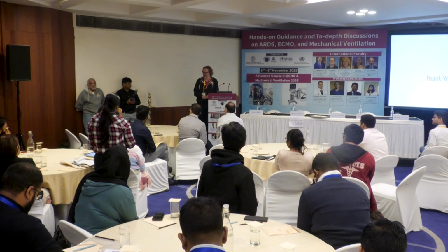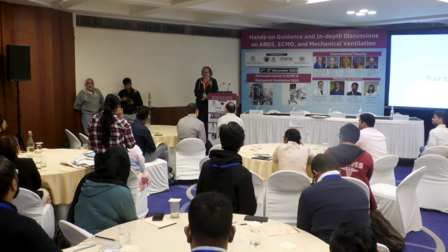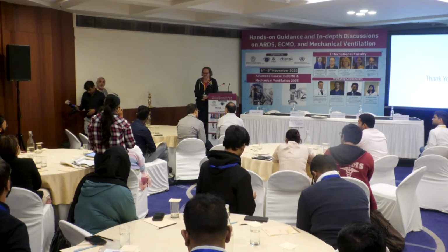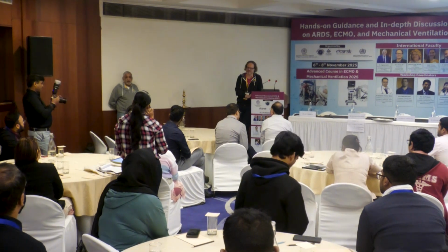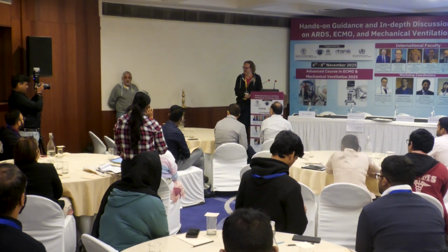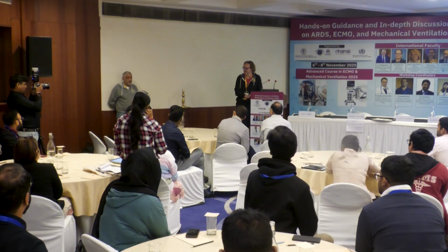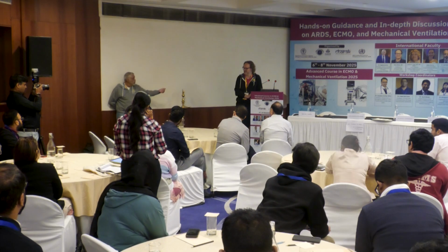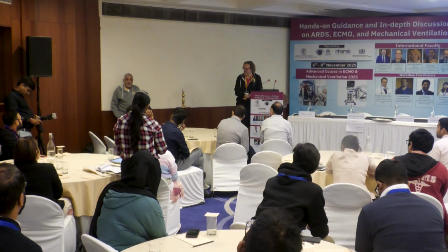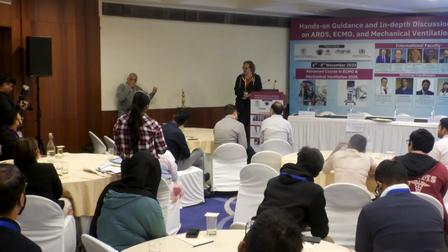Dietrich is, okay, so one of our, he's a cardiac surgeon, and he routinely uses cardiac echo to position the cannula. So I cannulated with him. I said, show me your technique. He was one of our residents. Now he has cannulated about 500 patients. So he was showing me what he does. He uses a probe, and he said, okay, that's where the vena cava is, that's the right atrium. So he pushes the lower cannula all the way.